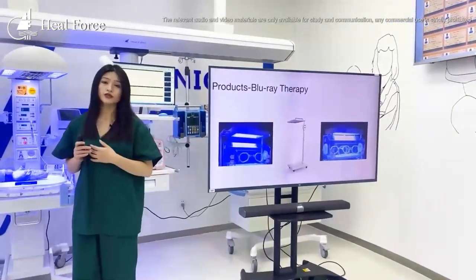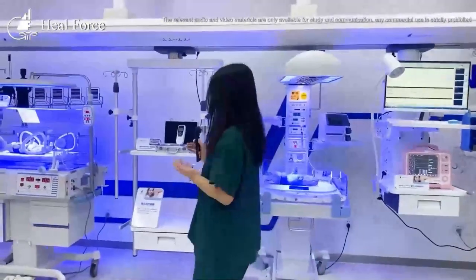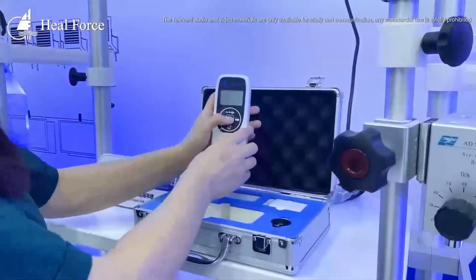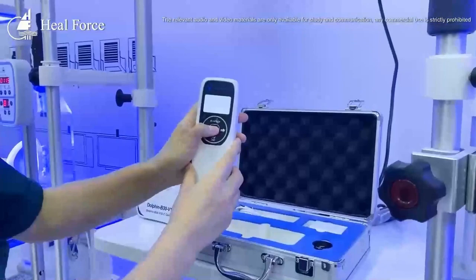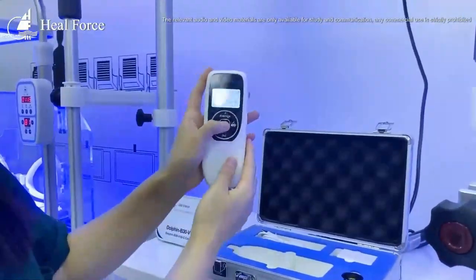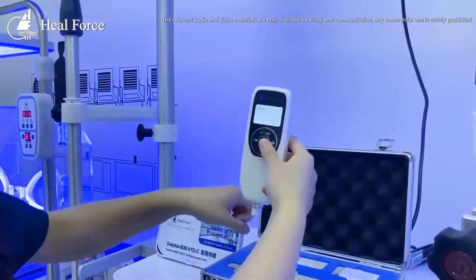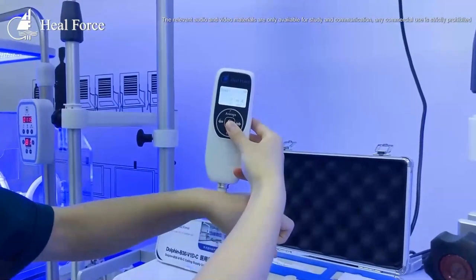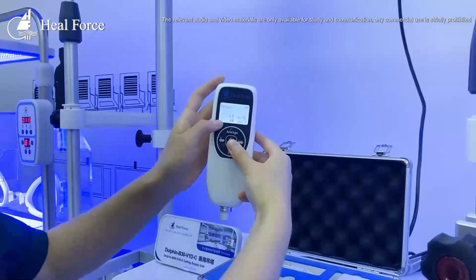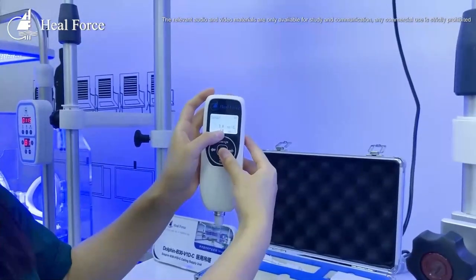How can we test if a baby has jaundice? We have this high-end technology — our jaundice meter. Once you start the machine and let it touch your skin directly, after the flash, you can read the numbers on the screen. This is the value of your baby's jaundice.